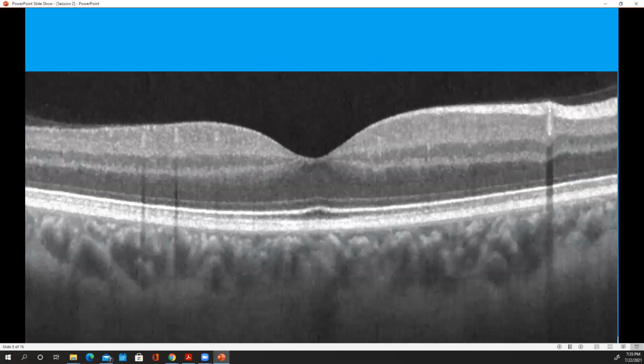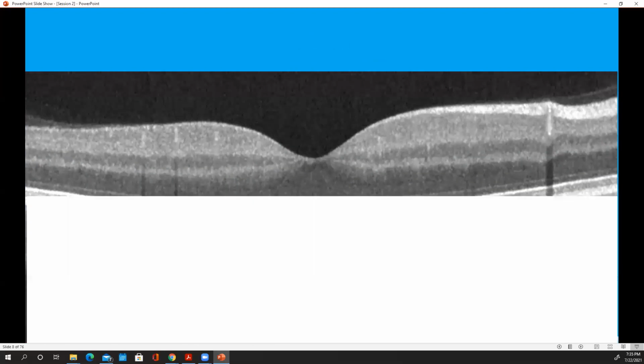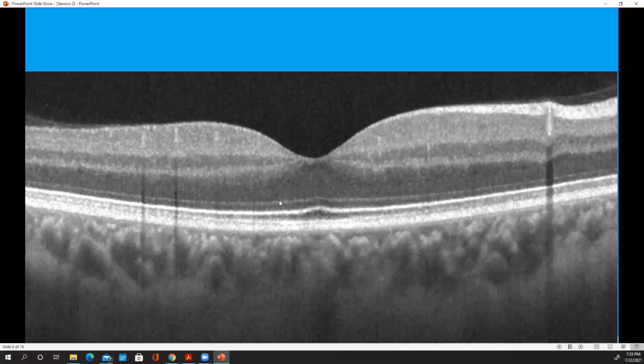Okay, so we're going to go through and I'm going to point to a layer and you're just going to tell me whether you think it's dark or light. That's literally all you're doing. What we're getting rid of here is the lines. Those lines are what we're going to focus on later. Right now we're focusing on these large sweeping bands that you see, so get rid of the lines and we're just going to point.